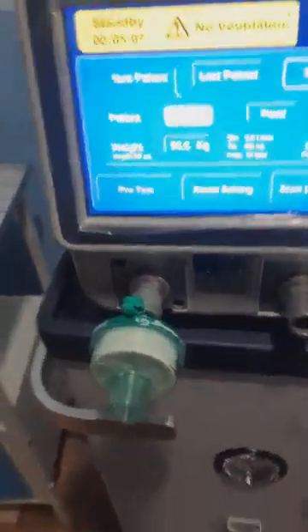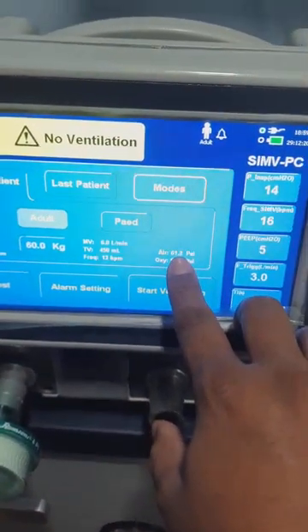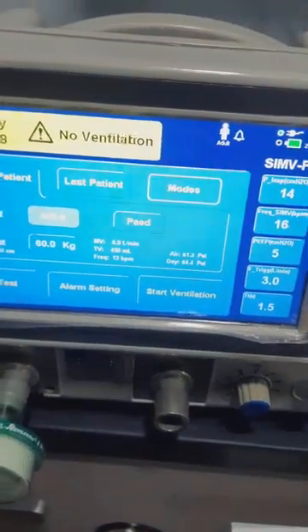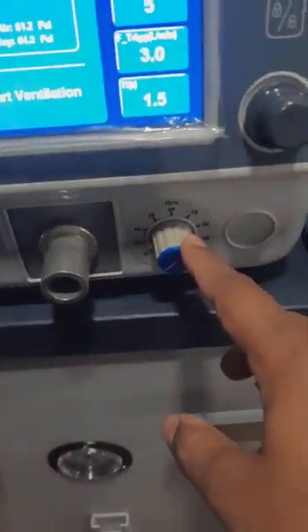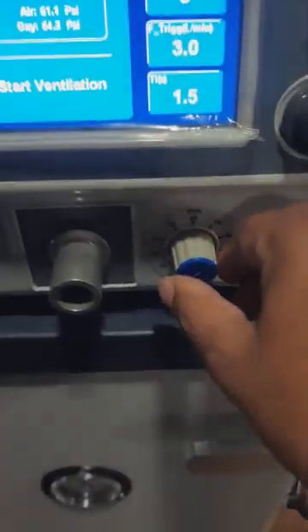We have now switched on the compressor. As you can see, the air column is showing a pressure of 61 psi. The pressure in both air and oxygen supply is supposed to be below 70 psi. The air delivered to the patient will depend on the FiO2 which we set.